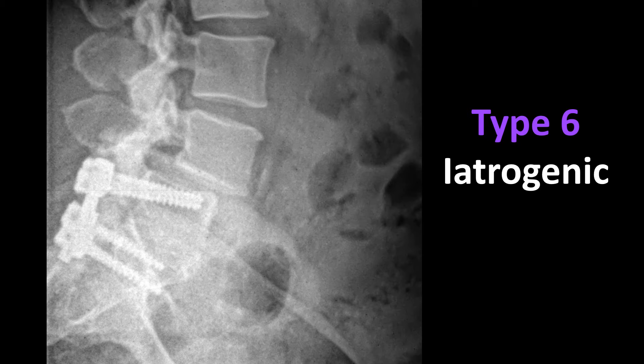Type 6 is post-surgical or iatrogenic spondylolisthesis. This usually occurs where there is some type of surgical fusion — in this case a posterior lumbar interbody fusion at L5-S1 stabilizing that region — but now there is excessive motion at L4 resulting in an anterolisthesis. This may be due to severe degenerative arthrosis or a developing pars defect, but it is usually post-surgical in etiology.